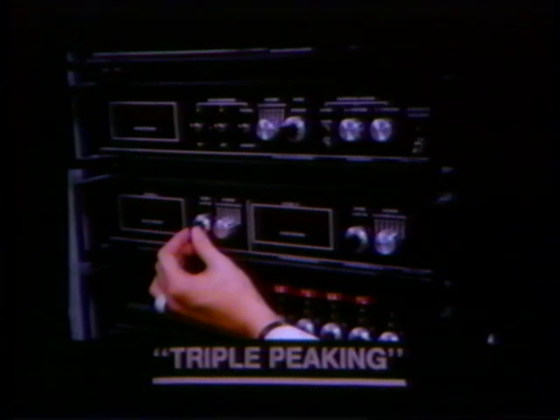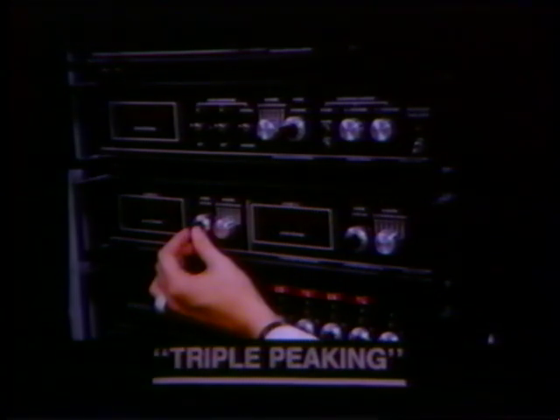At least one manufacturer now offers 4-peak capability. But this appears to be overkill since the 4th peak of gallium is only 4% abundant, and it is at such high energy that the crystal thickness is insufficient to stop all but a small percentage of the 4% emitted from the body.